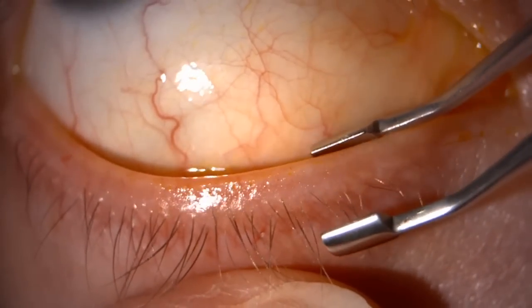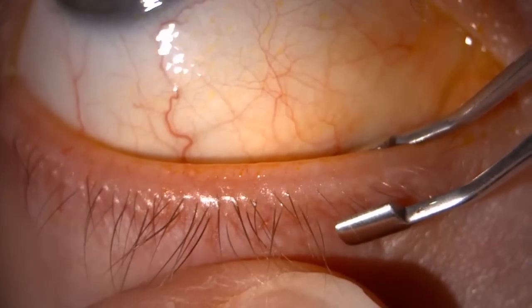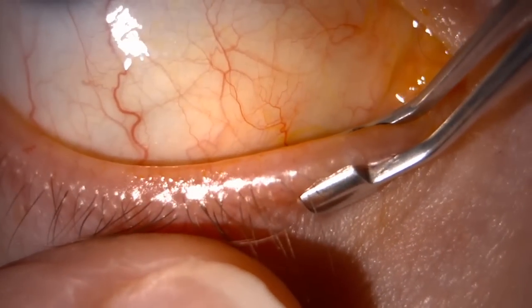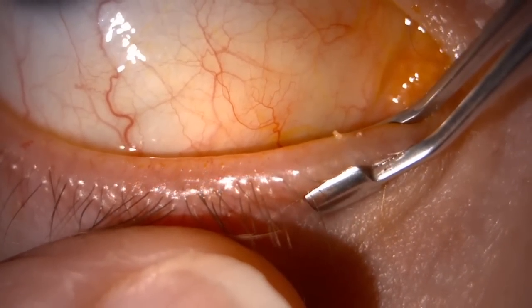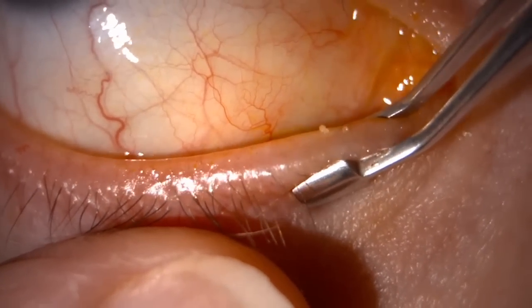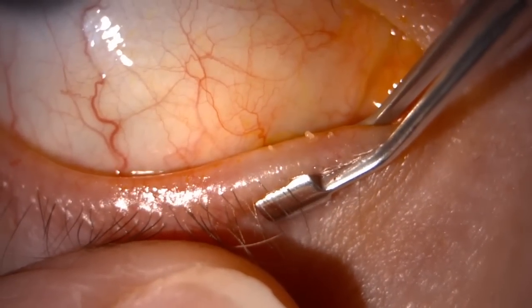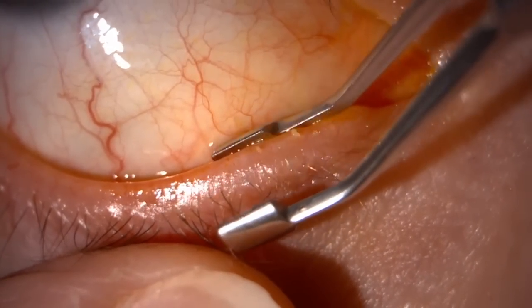You want to make sure the forceps tuck nicely behind the lid so they're not overlapping the edge, because that's when you tend to clip it. Press firmly on the forceps and ramp up the pressure until you get blocked meibum expressed, or until the patient can no longer tolerate the procedure.